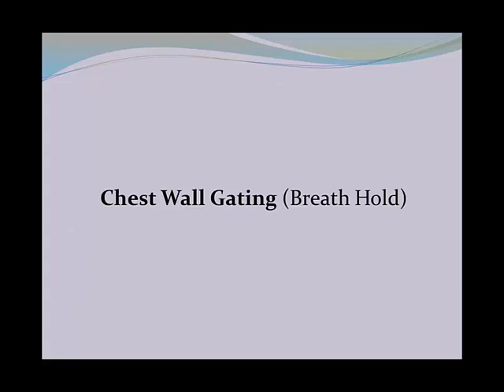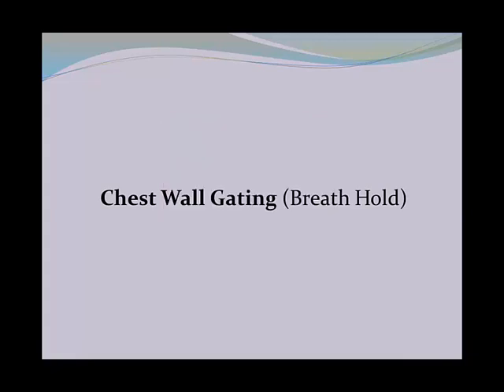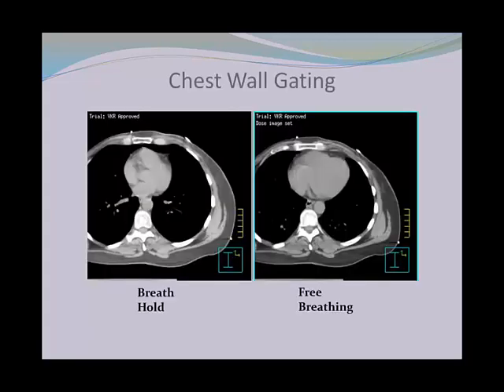So for chest wall using breath hold, sorry about that. We do breath hold on left breast and left chest wall patients. It has been shown to reduce the dose to the heart. By doing a breath hold, we're able to increase the lung volume and at the same time push the chest away from the heart, thereby reducing the dose to the heart.